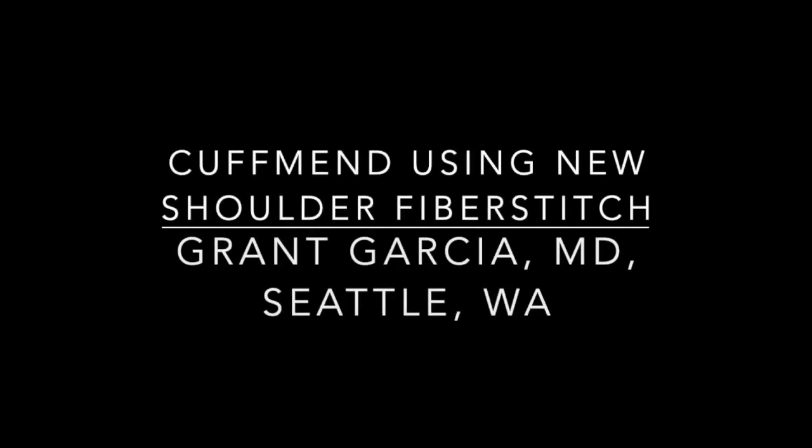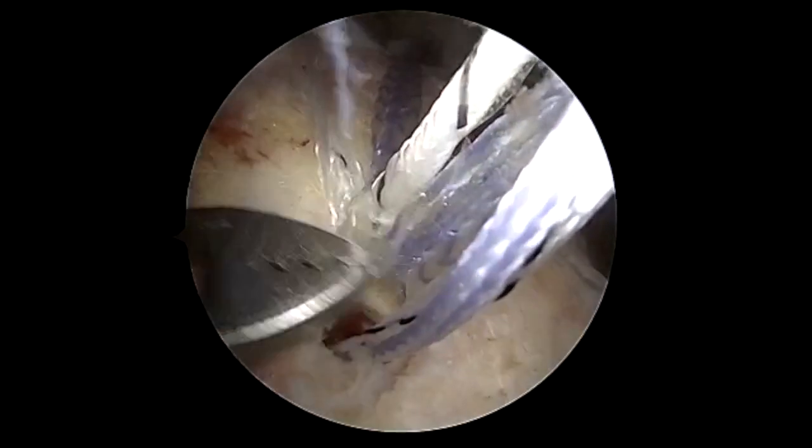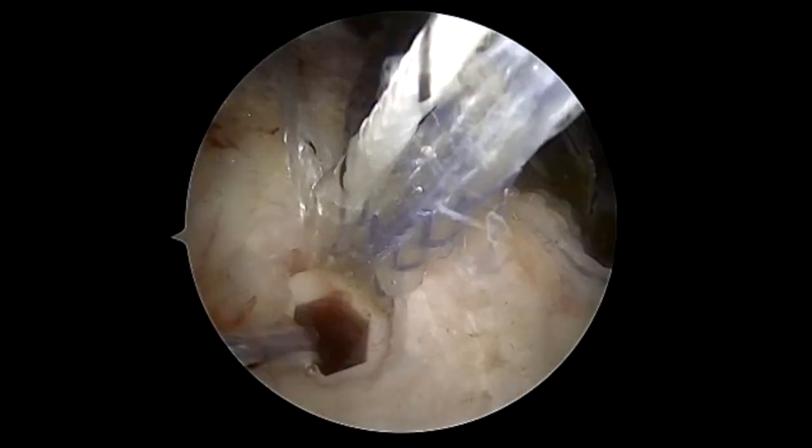Today we're going to show augmentation of a rotator cuff repair using the new CuffMend updated product line. This is a CuffMend patch, one millimeter dermal allograft, in addition to the newer shoulder fiber stitches which you'll see here.